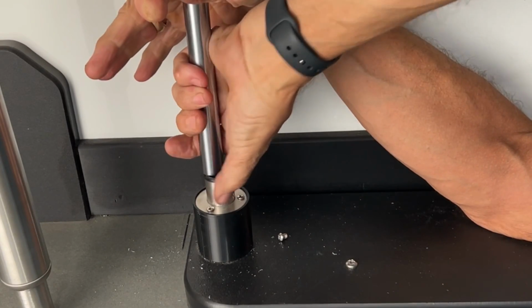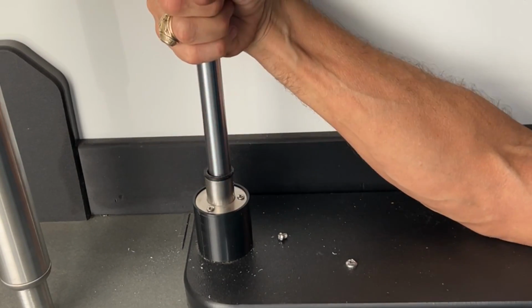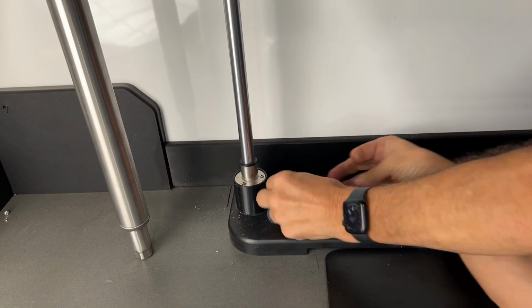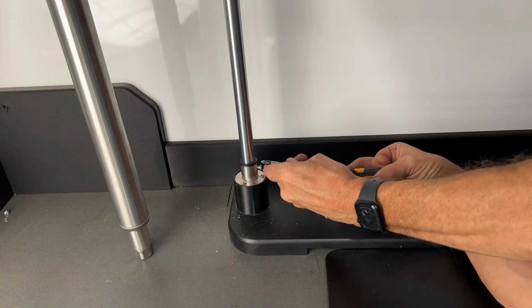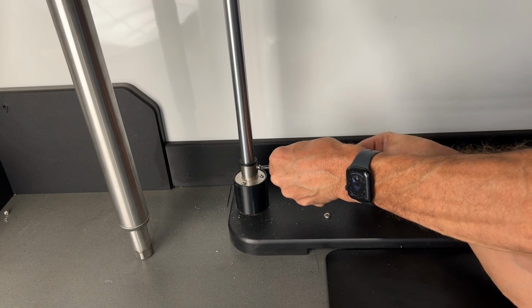Now let's go to the bottom of the rail and make sure that it seats all the way into the bottom of the flange. You'll know it. Yep, there you go. It's seated completely. Now find your set screw for the bottom flange, get it started by hand, and then use your Phillips screwdriver to tighten that screw. This will use a number 2 Phillips screwdriver.